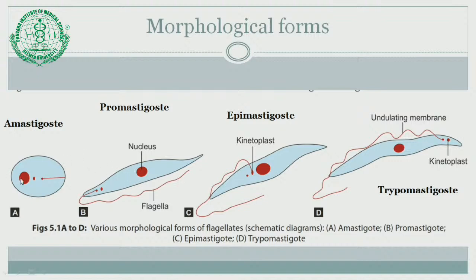You can see here the nucleus and the position of kinetoplast as well as the flagellum. With respect to the position of kinetoplast and nucleus, these morphological forms can be differentiated. Three morphological forms are flagellated and one is aflagellate — it is called the amastigote. The remaining flagellated forms are promastigote, epimastigote, and trypomastigote.